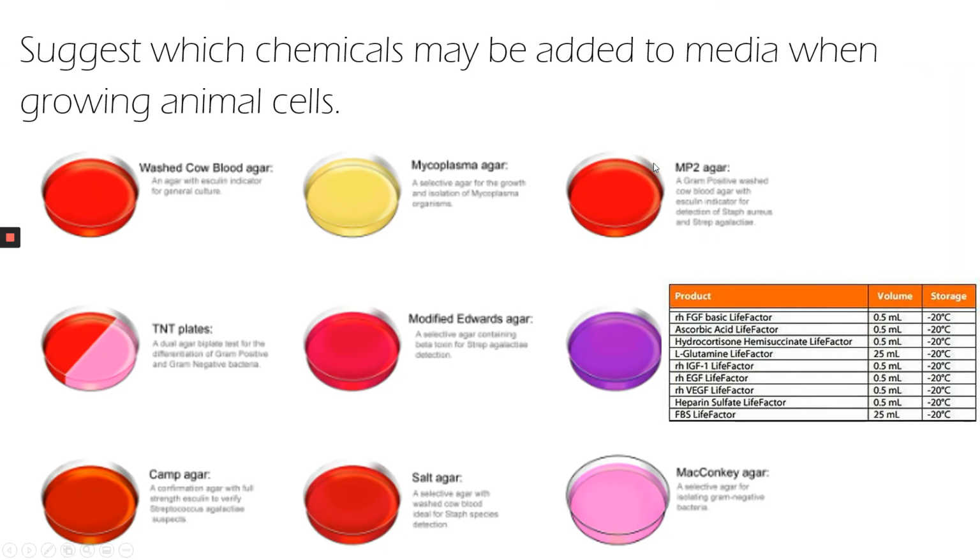There's many different culture media that can be bought in or made up, and each will promote the growth of specific types of cells or microbes, depending on which growth factors and which nutrients have been included. Growth factors are proteins that promote cell growth and proliferation. They're essential for the culture of most animal cells. So just taking a cell from the human body, for example, and putting it on agar will not work. We need to know what the animal cells are going to need to grow and how to grow them. And again, we're going to need to use aseptic techniques.